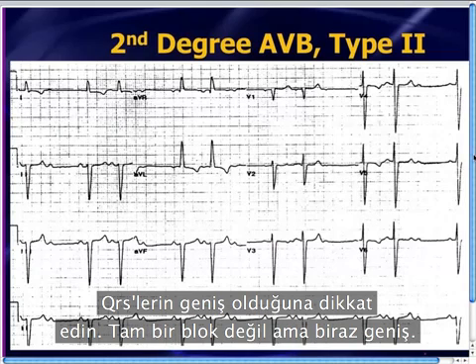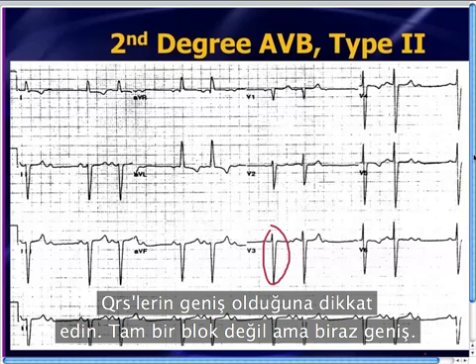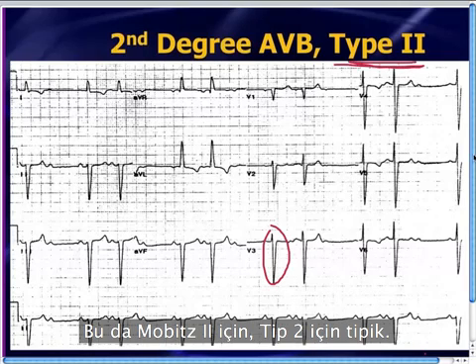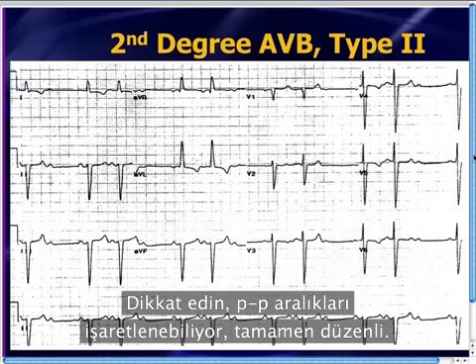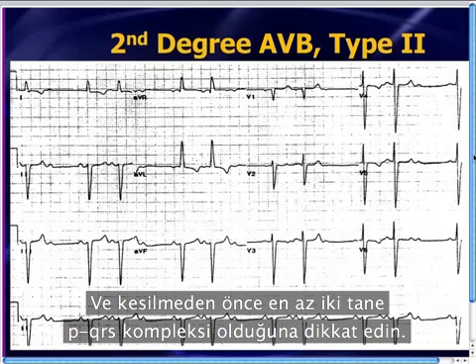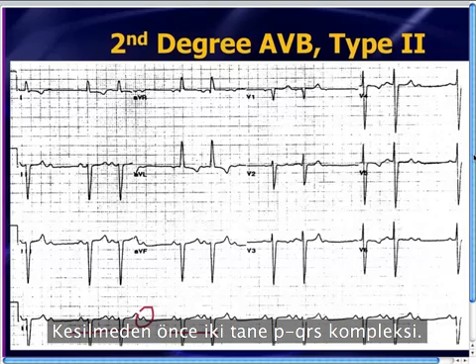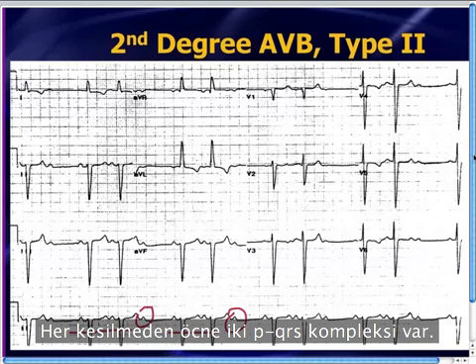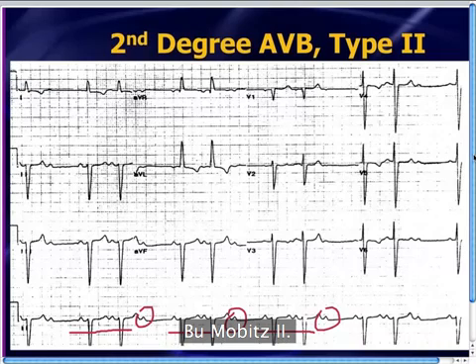Here's your type 2. Notice the QRS is slightly wide — it's not a full bundle, but it is slightly wide, which is typical of Mobitz 2. Notice once again the P-to-P interval is completely regular if you map it out. The PRs are constant everywhere, and there are at least two PQRS complexes before each drop. That's your Mobitz 2.